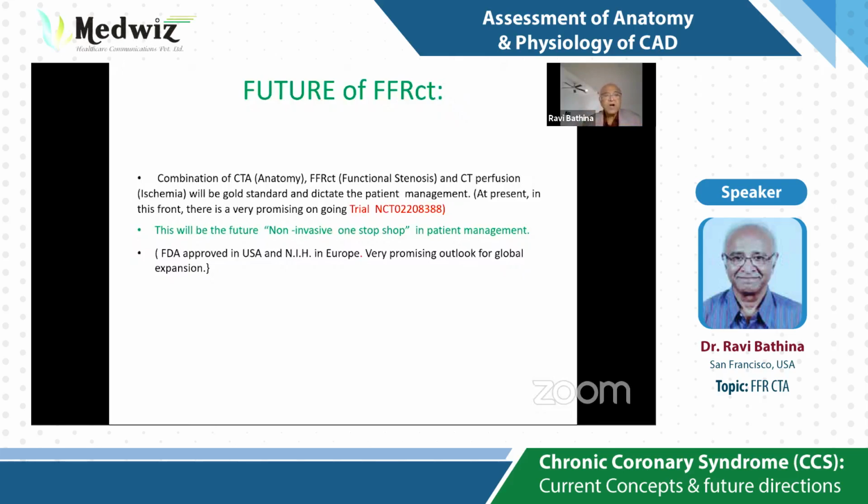At present, there's an ongoing trial, which will be coming out within 2 years. That will hit the nail on the head that with CTA, FFR CT, and CT perfusion, non-invasively we can get by. This will be the future non-invasive one-stop shop in patient management.